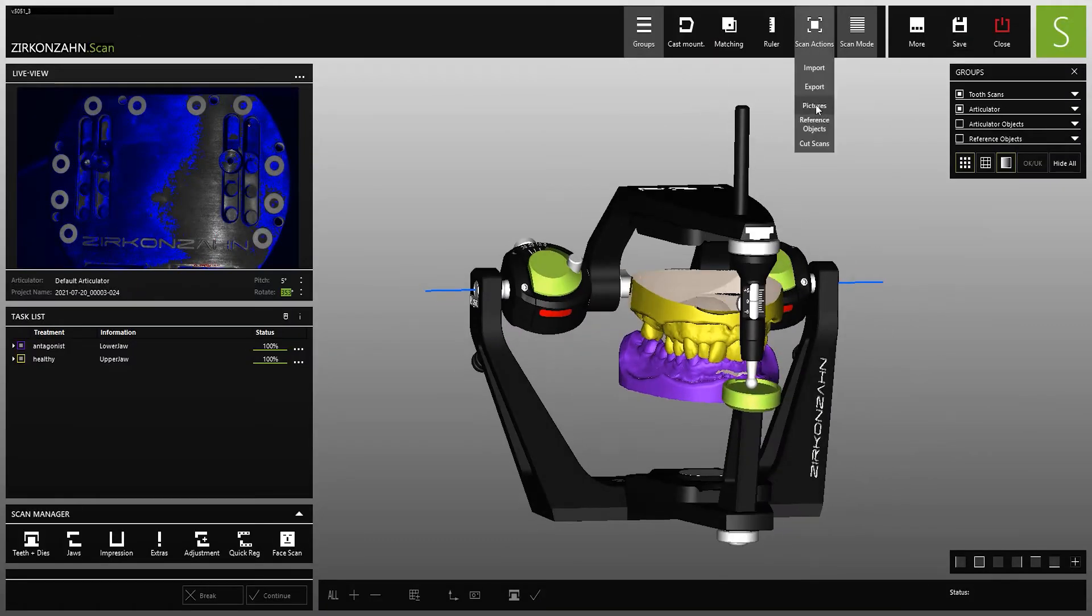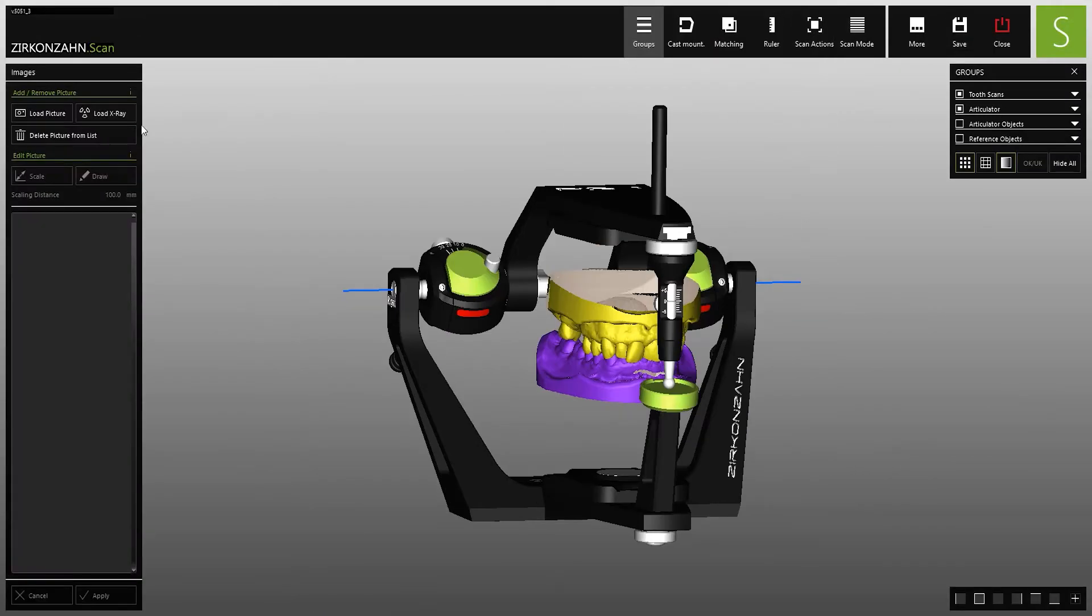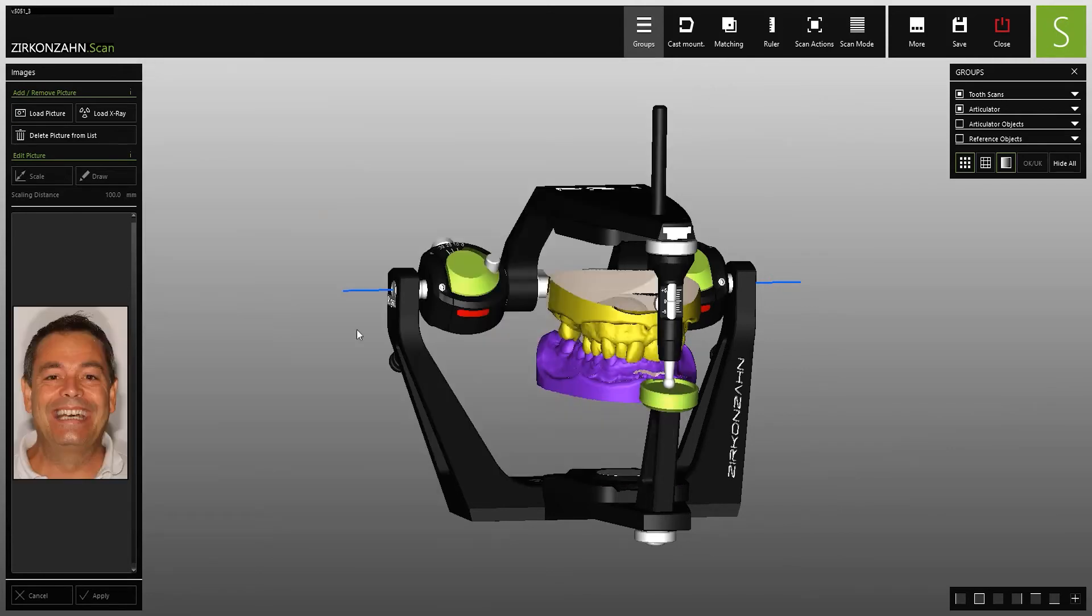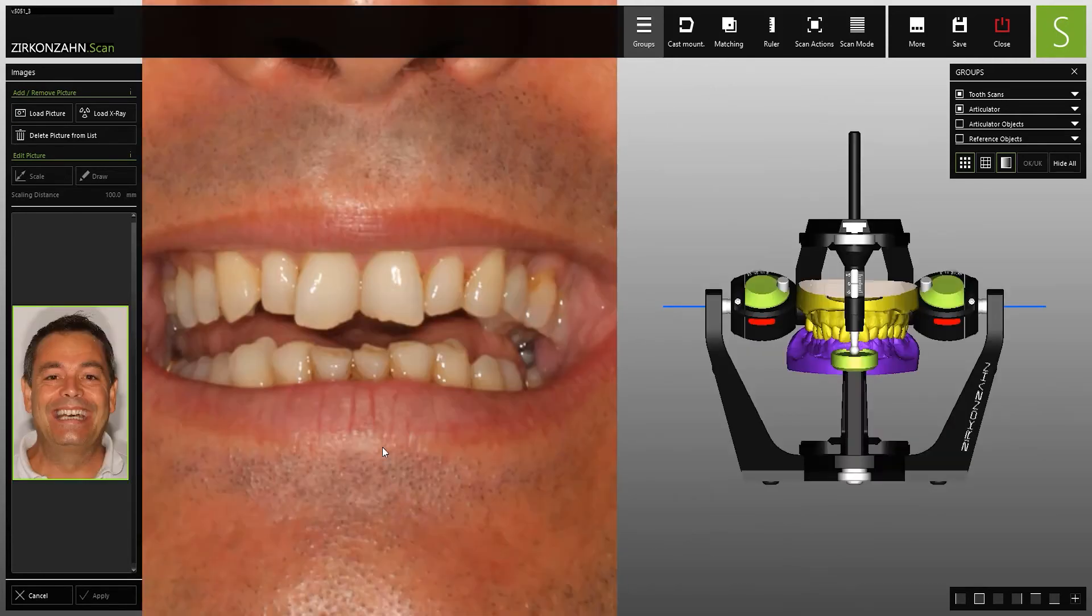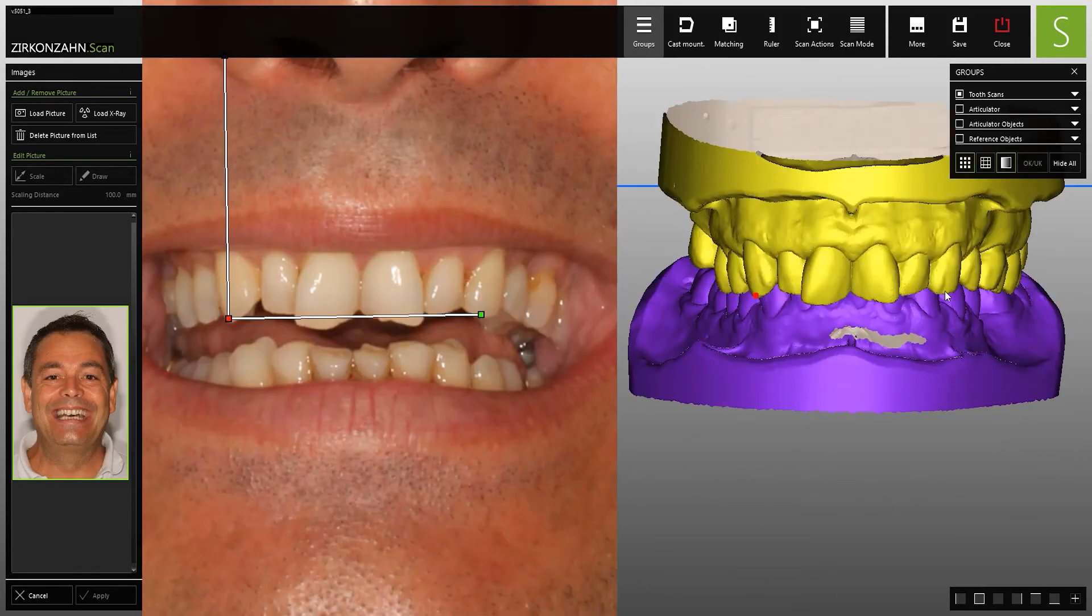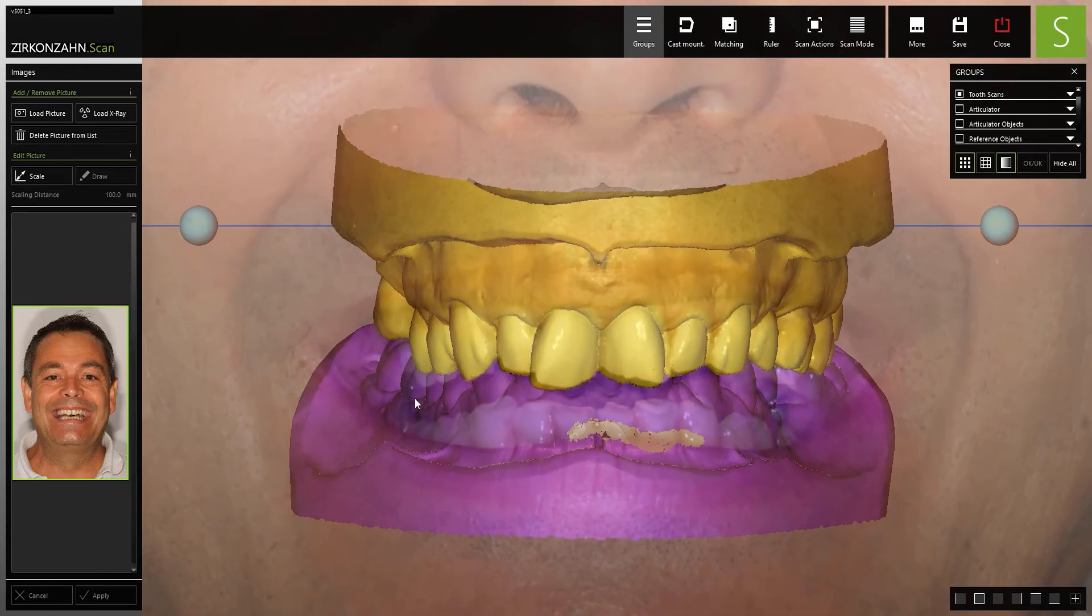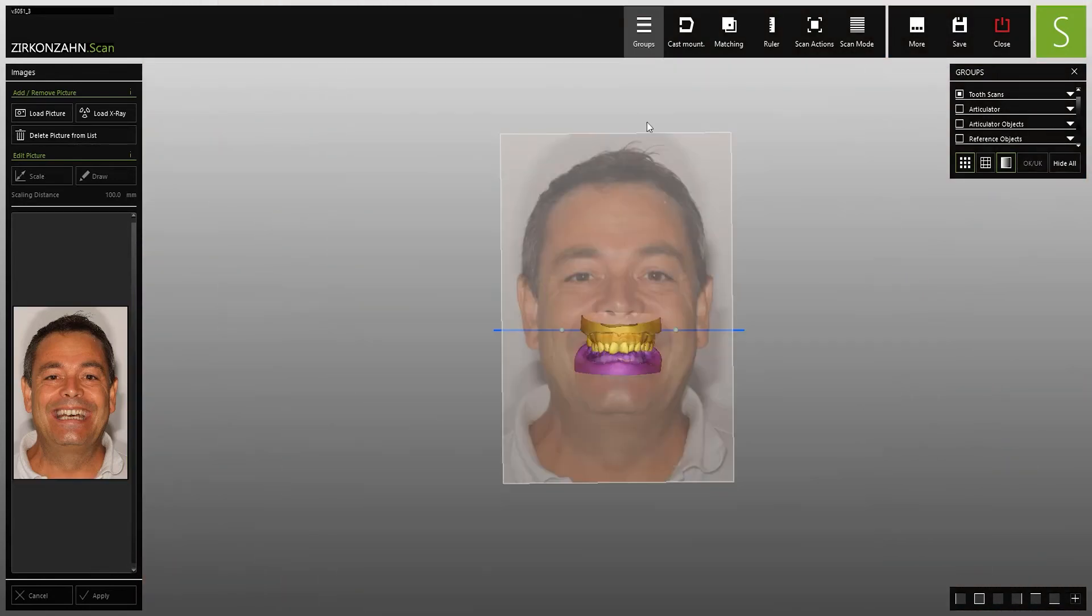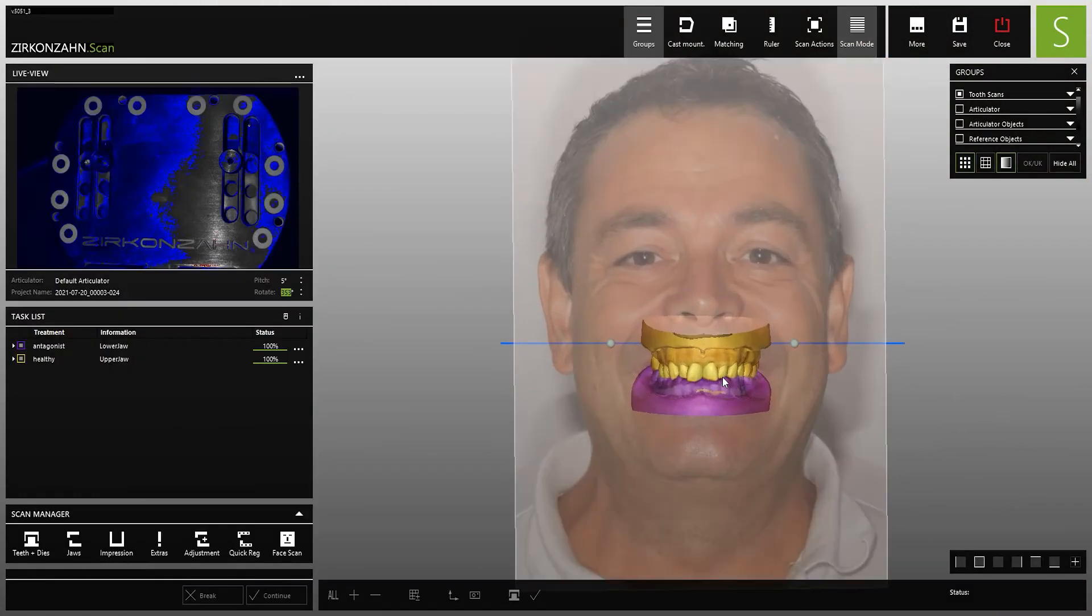Furthermore, the software offers various import functions, such as the importing of 2D images. These can be very easily matched with the 3D models, helping with the realization of the restoration.